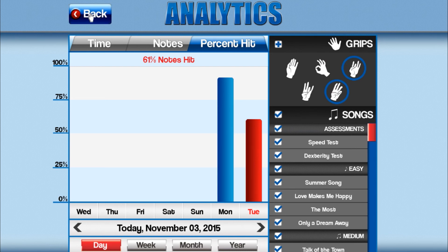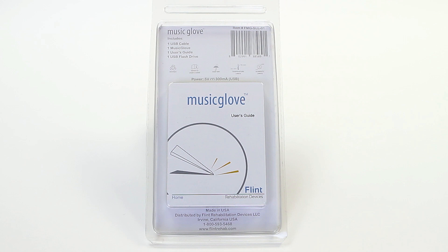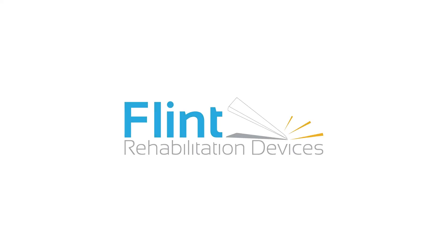Select Quit to exit the game, or press Escape on your keyboard. We encourage you to read through the user's guide for additional information. If you have any questions or concerns, please contact our support department and we will be happy to assist you. Thank you for choosing Flint Rehabilitation as your home therapy partner.